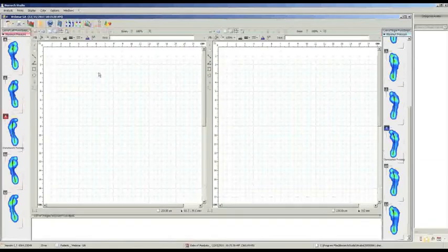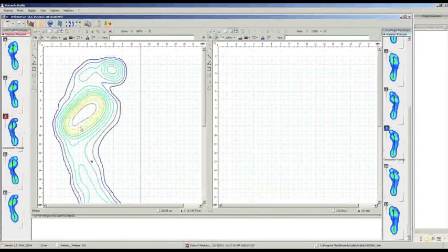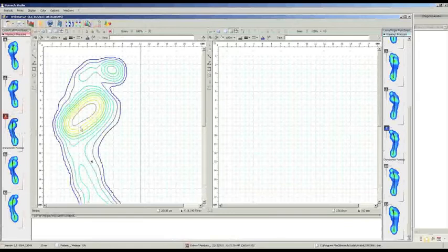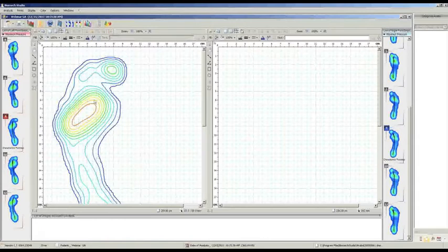Then we have this visualization, which is very important for making measurements on the footprints. It is possible to choose which footprint to evaluate and move it onto a graph where it is possible to visualize the isobaric curves of the foot. So we can see the distribution of pressure detected by these isobaric curves, and with different tools it is possible to make measurements of the length and the width of the foot depending on what we want to detect.